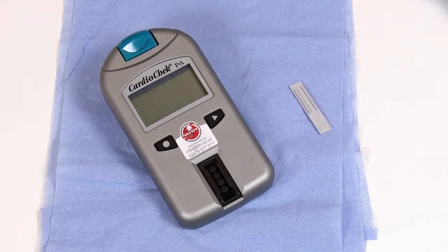A grey check strip is included in the analyzer carrying case to verify the CardioCheck's basic functionality of the electronic and optic systems. This test should be carried out at the beginning of every testing day.